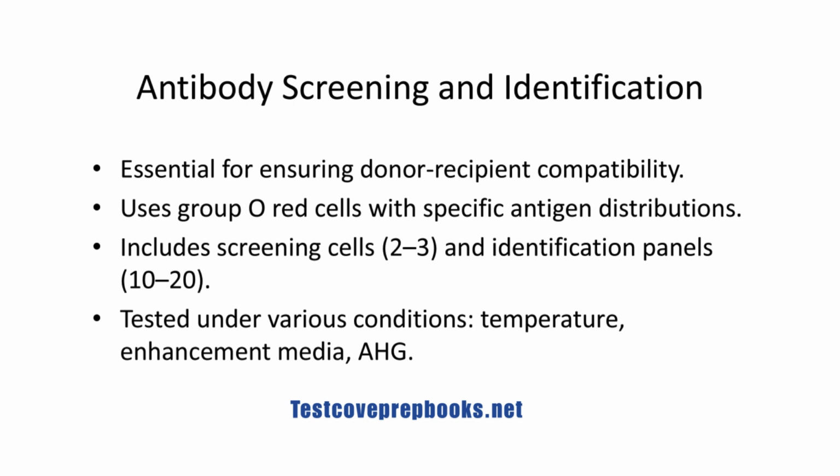Antibody screening and identification. In transfusion medicine, antibody screening and identification are essential for ensuring compatibility between donor and recipient blood. This process involves the use of commercially prepared Group O red cells, which are selected for their specific distribution of blood group antigens.